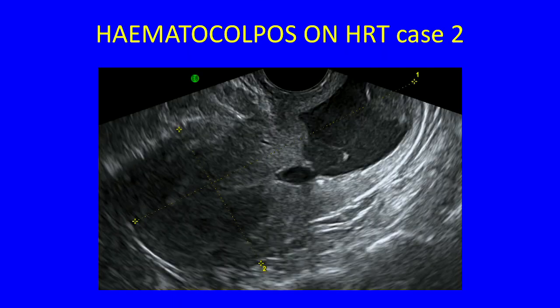And then this lady came to the postmenopausal bleeding clinic. She was in her 60s, she was on HRT, and she'd had a tiny little bit of discharge, not properly bleeding, but she'd had some pelvic pain and was concerned. And when I did her ultrasound, this is the anteverted uterus, we could see blood here in the cervix. And of course, the first thing you have to think in somebody who's postmenopausal with bleeding and a funny cervix is that it's malignant. That would be your first thought.